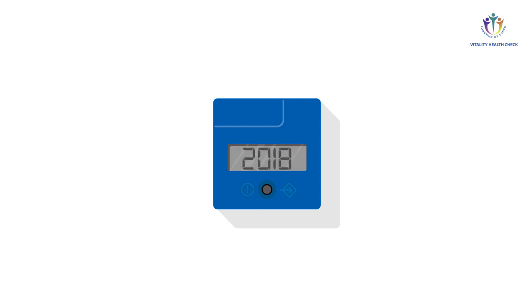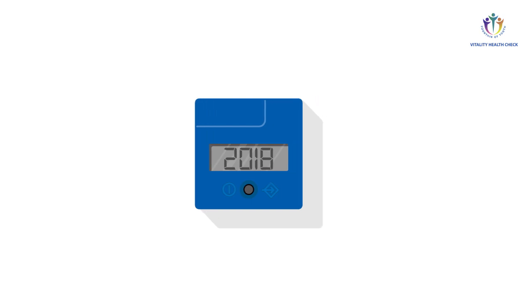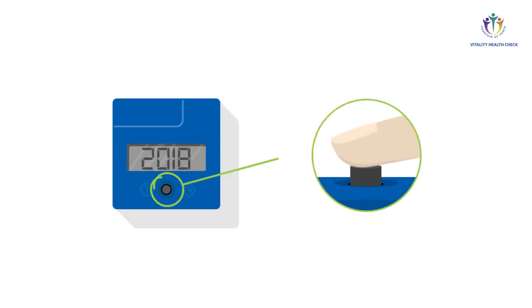Accurate date setting is important in order to control whether the test cassette has reached its expiration date. Press the control button long to change the current date settings.